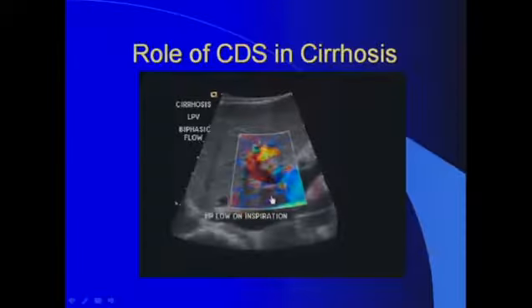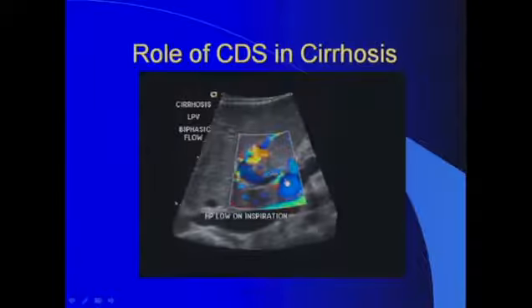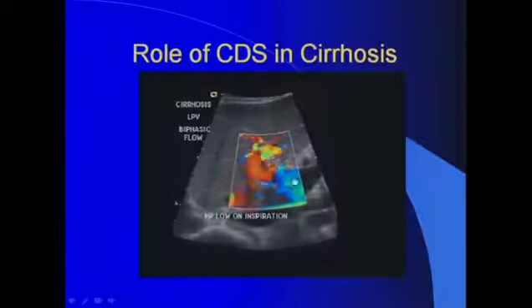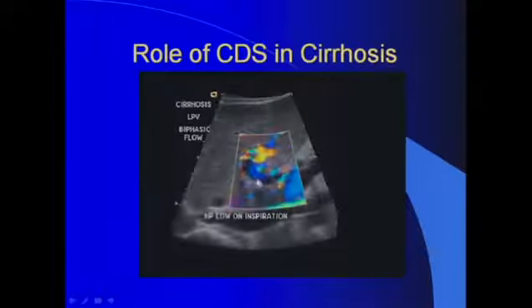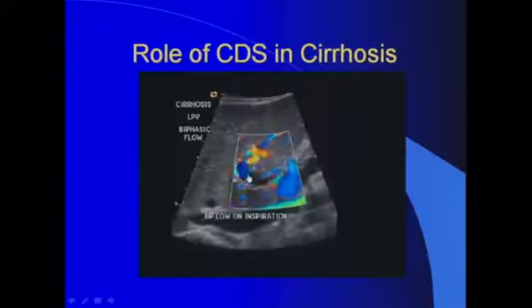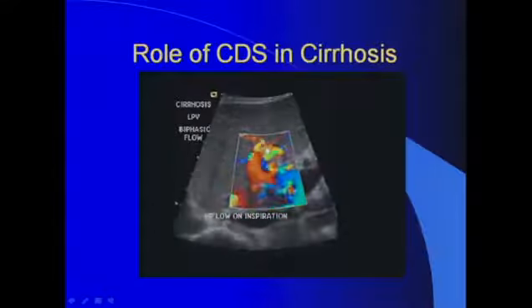So in this example, we can see that there is obviously biphasic portal venous flow going into and outside of the liver. Look at this changing color from red to blue. In addition to that, you need to focus also on what's happening next door in the arteries. Look at the high velocity aliasing in these arteries adjacent to the vein.